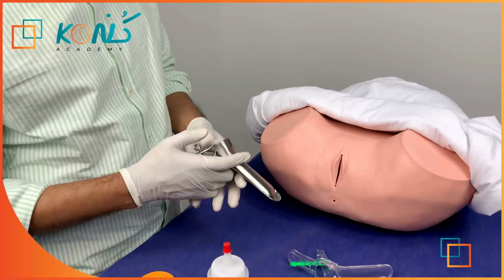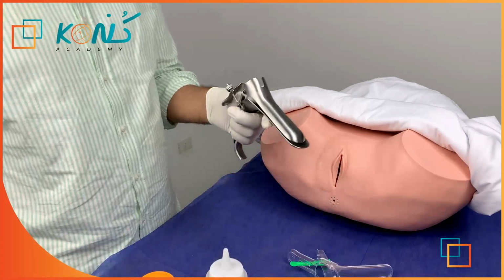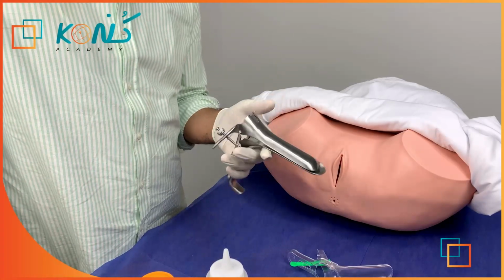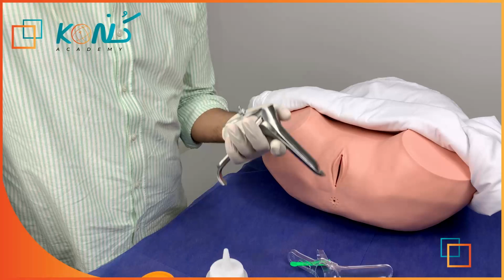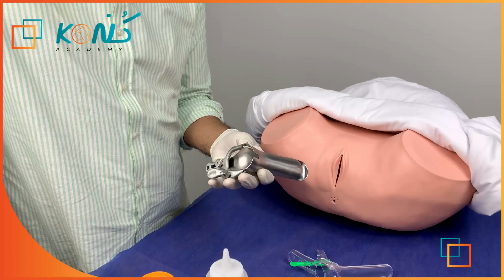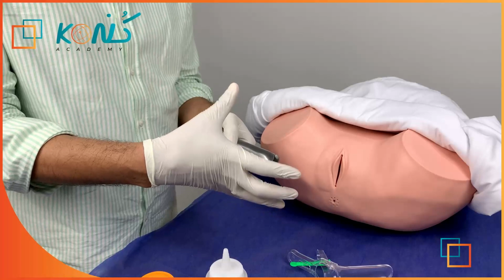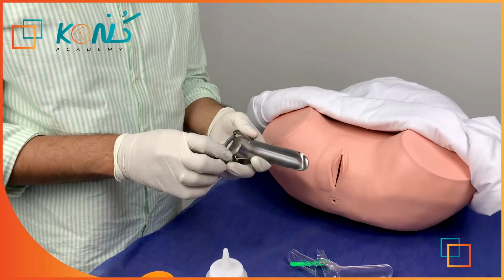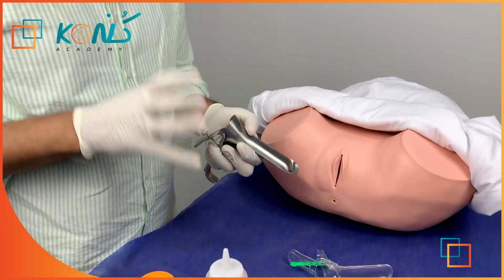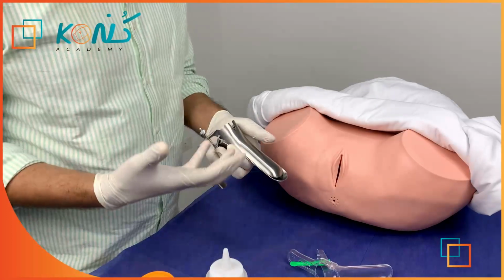Before starting to pick it, we are lubricating this speculum. However, a very minor scientific tip here about lubricating the speculum: ideally, if you are about to do a cervical screening test, taking a sample, it is advisable not to lubricate the tip to avoid contamination of the samples that you will take. And they are also advised to use special types of gel. Okay? And so this lubrication ideally should be avoided if you are about to take a sample.